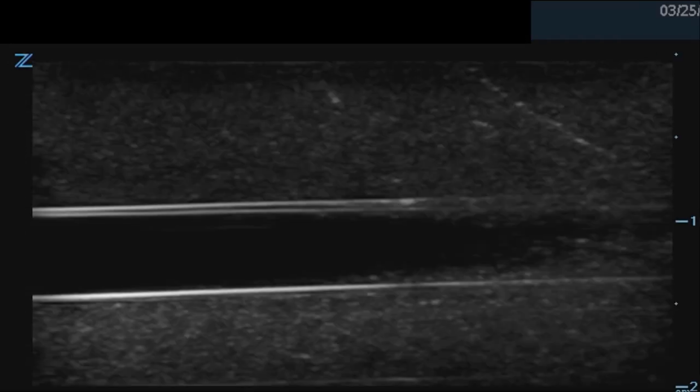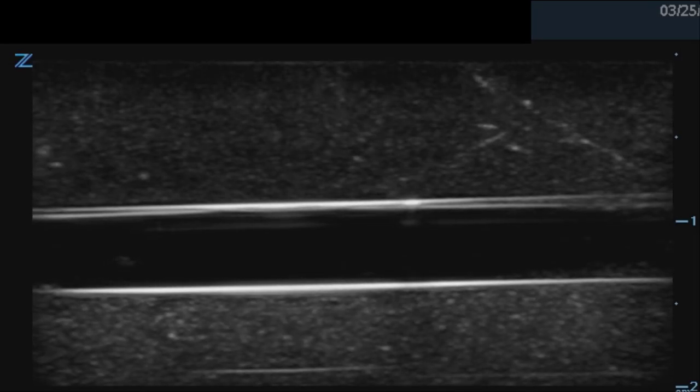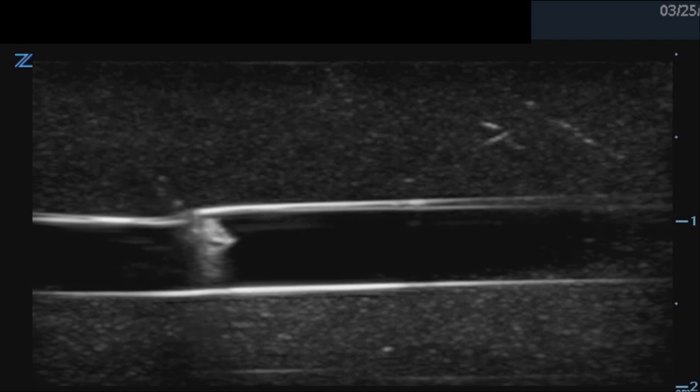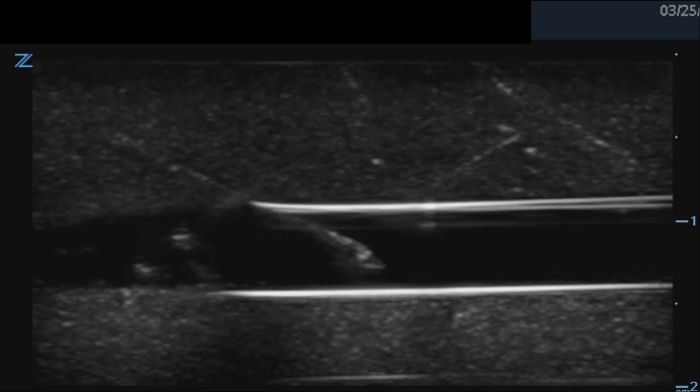Though we're recommending that you start placing ultrasound-guided IVs with your probe transverse to the vein and needle, you should also learn how to place them in a longitudinal orientation as depicted here. Notice how the angle of the needle is adjusted to a more shallow angle after the vessel wall is breached.